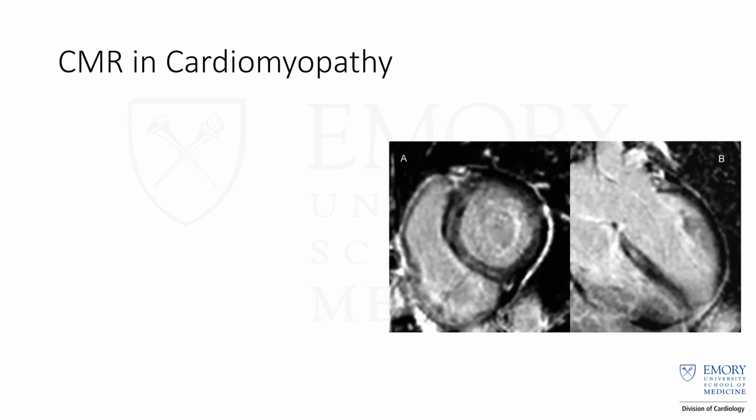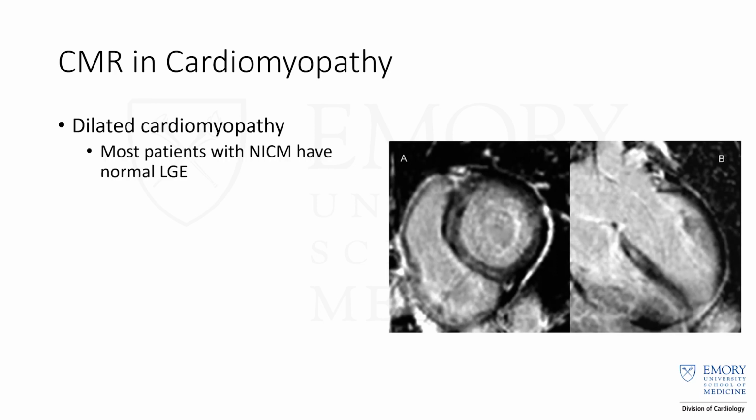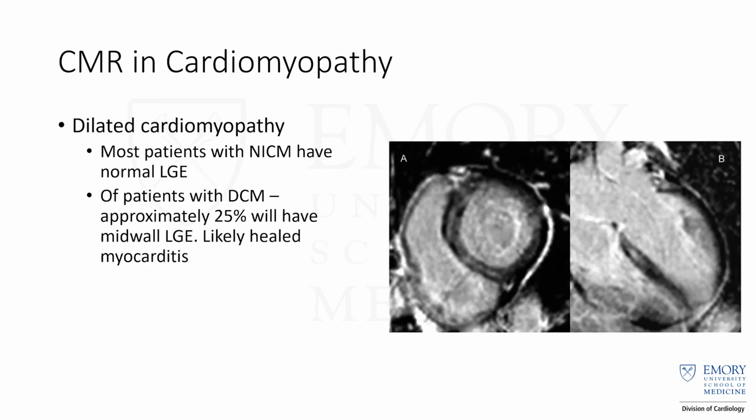So I'm going to talk about all the different cardiomyopathies that you can evaluate with CMR. The first is just your dilated, non-ischemic cardiomyopathies. People will send us patients that have low EF and don't have coronary disease, and they're looking for the etiology of heart failure. The vast majority of patients with non-ischemic cardiomyopathy typically have normal gadolinium images.